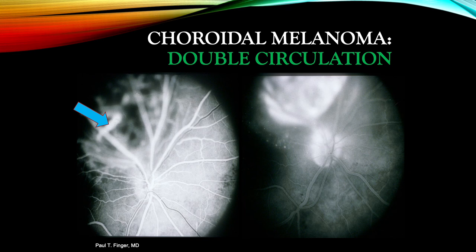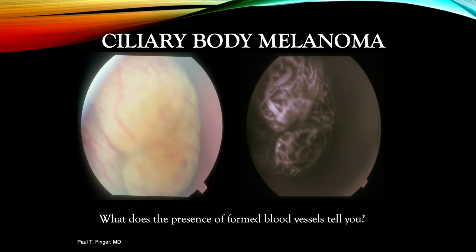Also note that the serous exudative retinal detachment is mildly hyperfluorescent. Here, on the left, we see a color photograph of an anterior uveal melanoma. Its relatively amelanotic surface reveals multiple formed intrinsic tumor blood vessels. Fluorescein angiography reveals even more formed tumor blood vessels. The presence of large formed blood vessels suggests that, unlike other choroidal tumors, this melanoma grew over a significant period of time, which has yet to be investigated.